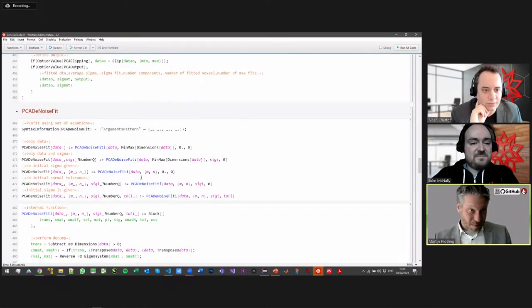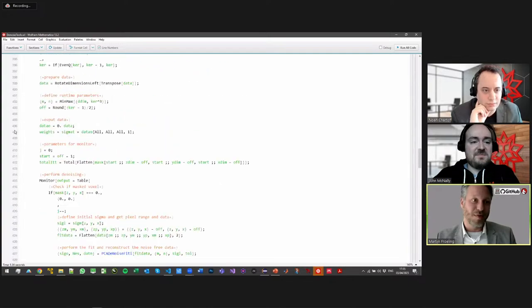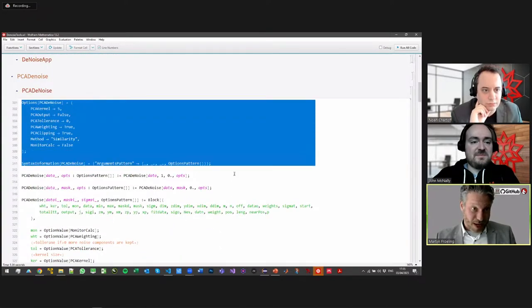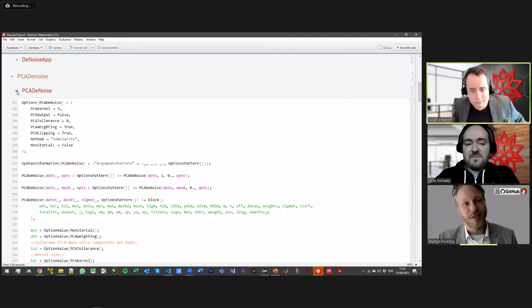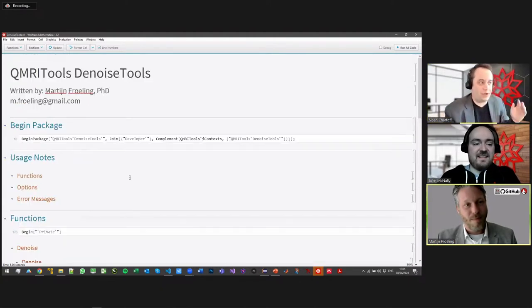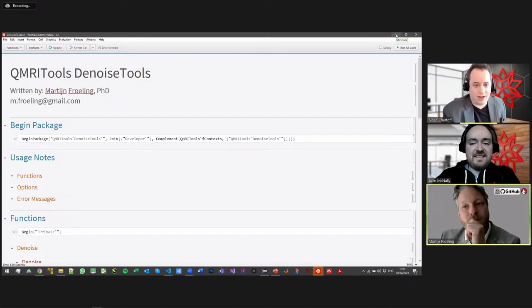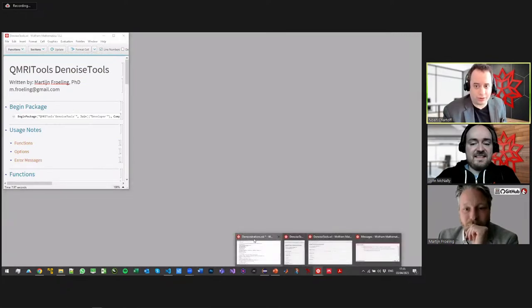But yeah, this is how I build up my toolboxes in general. Everything is highly organized. All the functions have usage code, and I try to also be quite structured with adding syntax information to everything, so I can have user input checking, so the user gets feedback like, are you using the correct number of arguments, those kinds of things. That's a wonderful thing. I love how much of that is built into our built-in functions, so I'm so glad that when people are making their own functions, their own tools, they'll be able to do that.